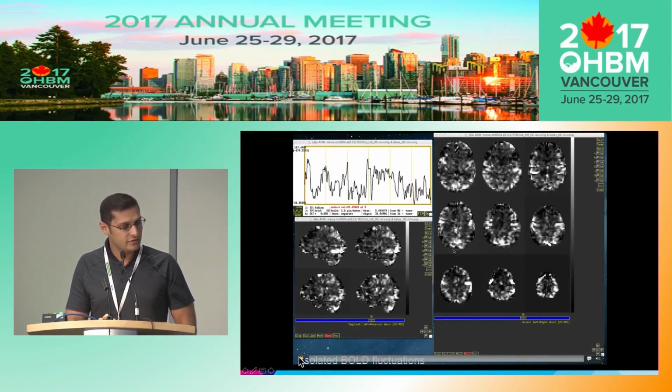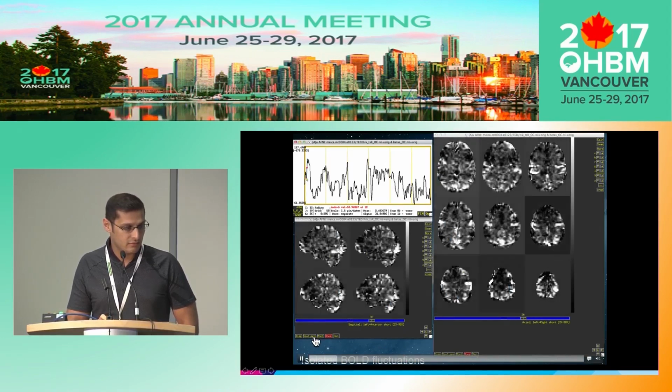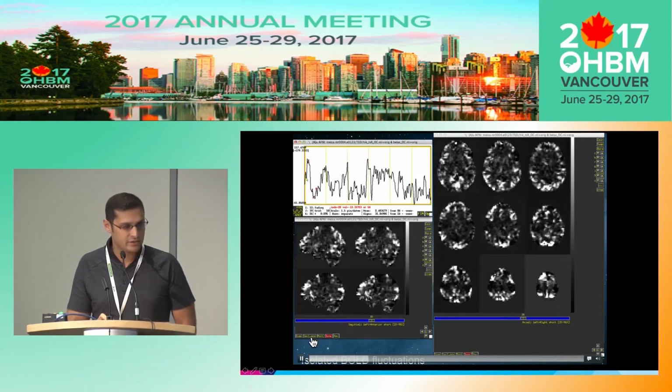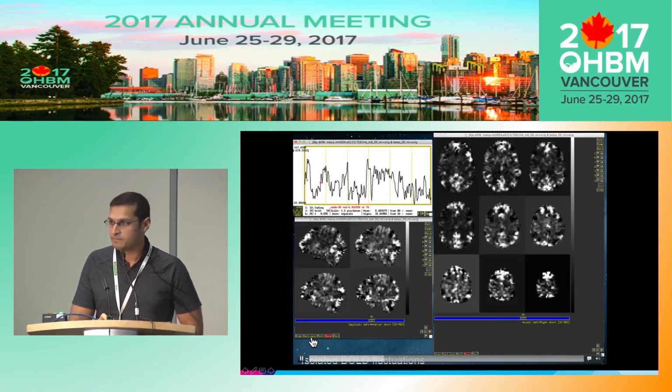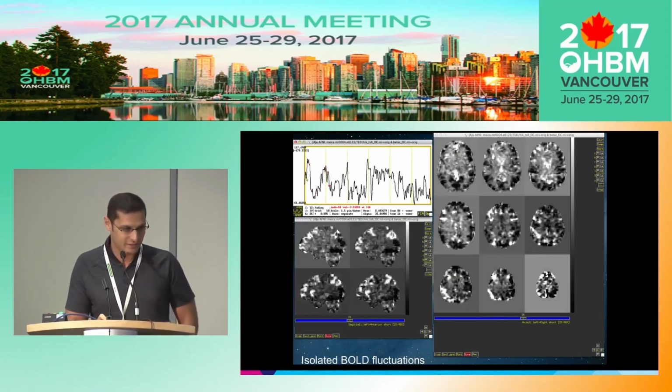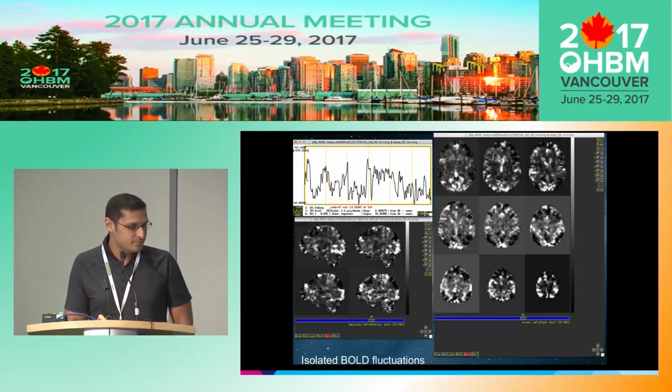If you just subtract the first data set from the second, this is the resulting data that you get. You can actually see the networks evolving over time as a movie. So it's almost like instantaneous correlation with the limit of delta t going to 0.